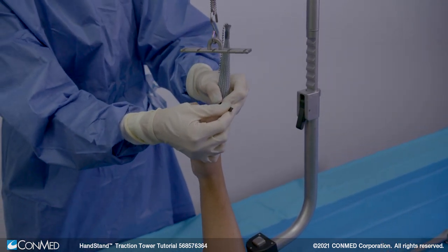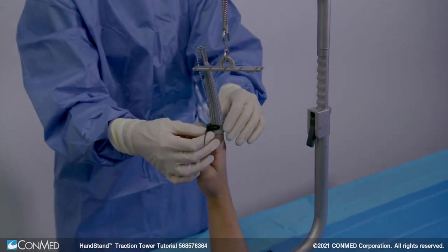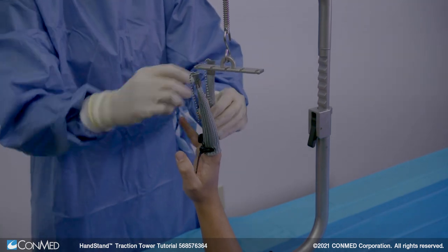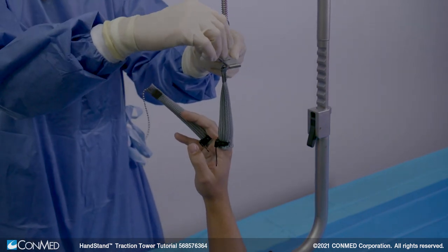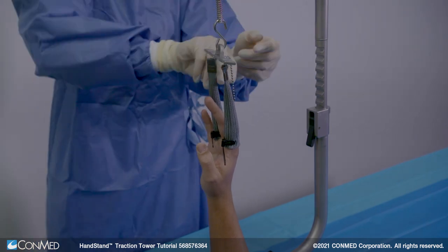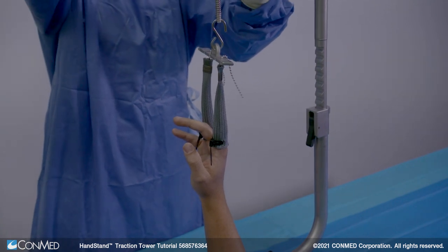Digit traps should extend beyond the proximal interphalangeal joints to prevent slippage. Adjust the cable tie on each digit trap to lock at the base of the patient's finger. The cable tie is always able to be released and tensioned. Then, place the ball chains on the digit traps into the recesses of the scale rack to attach the digit traps to the handstand. Ensure the ball chains securely rest in the scale rack detent.